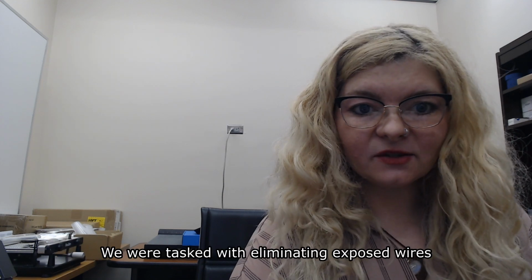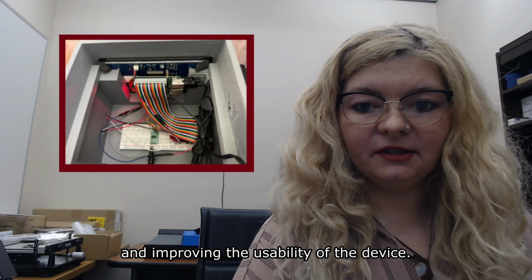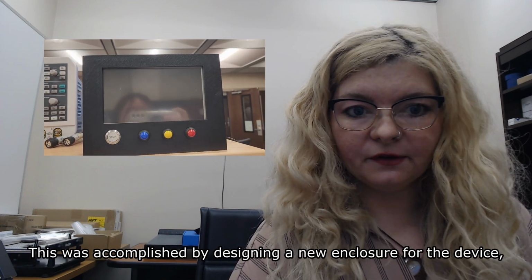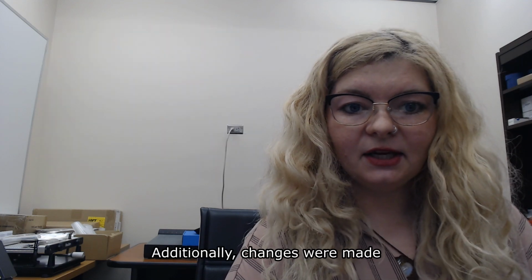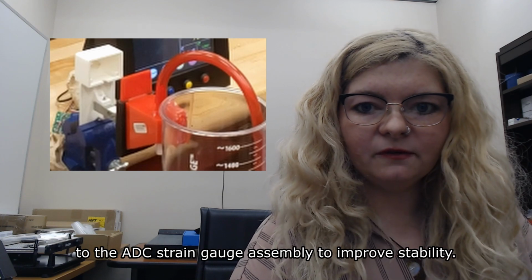We were tasked with eliminating exposed wires and improving the usability of the device. This was accomplished by designing a new enclosure for the device, implementing operating room-friendly buttons, and upgrading the user interface. Additionally, changes were made to the ADC strain gauge assembly to improve stability.